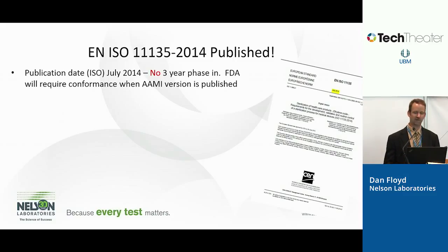One of the things with a lot of these standards, when they change, and this is a big one because it talks about ethylene oxide sterilization validation, is that normally there's kind of an unwritten rule that there's a 3-year phase-in period, so you don't necessarily have to have compliance for 3 years from the date of publication. That's what happened with the residual document, ISO 10993-7.